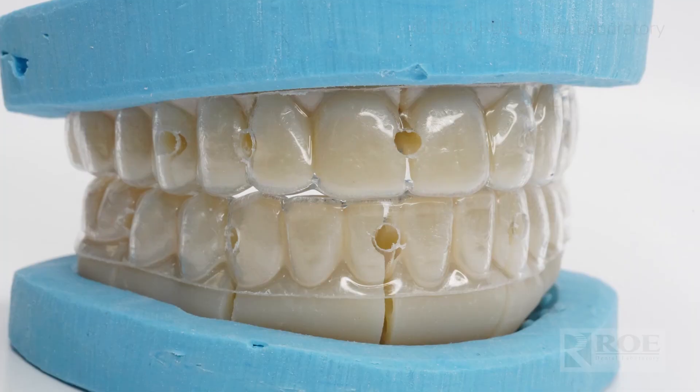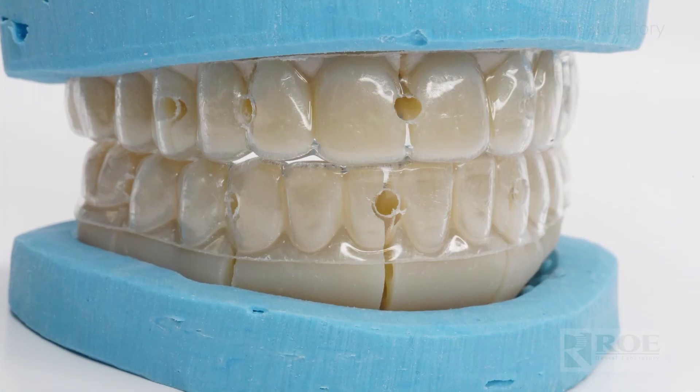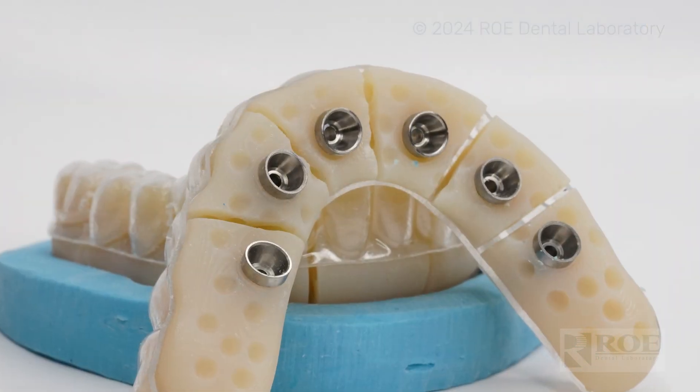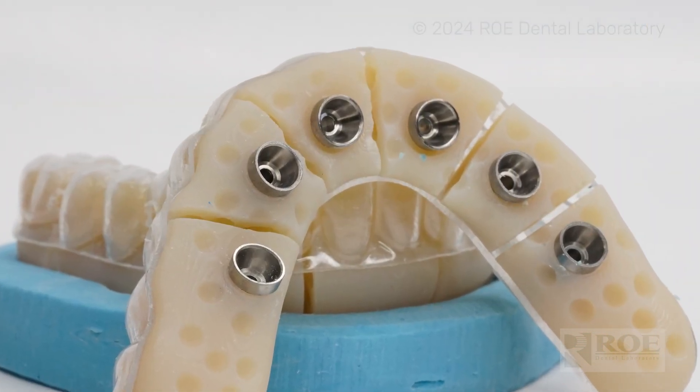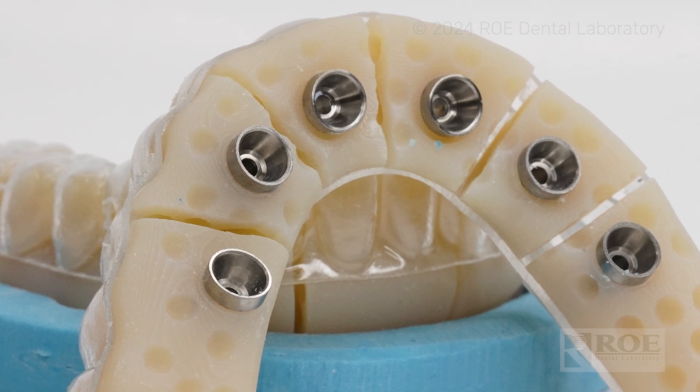When we're doing that design, we're also going to design you a verification jig. We all love digital workflows, but we want to make sure we also have a verified model to work off of when we go to a final zirconia. With that same design, we'll send you the eye jig — it's a sectioned verification jig, a duplicate of the design we made for you on the day of surgery. A couple days later, UPS is going to show up with your sectioned eye jig.